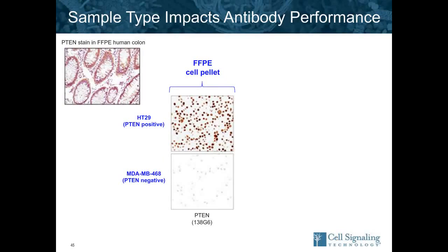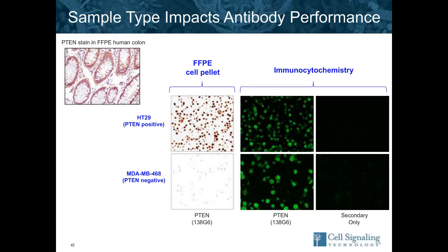And we also did formalin-fixed paraffin-embedded cell pellets, and you can see in the PTEN positive cells on the top, it's a nice correct stain, and on the PTEN negative cells, they're negative. However, when we did immunocytochemistry with these same cell lines, you can see that the PTEN negative cells also have stain. So in this case, how the sample is prepared makes a big difference in how the antibody will perform.